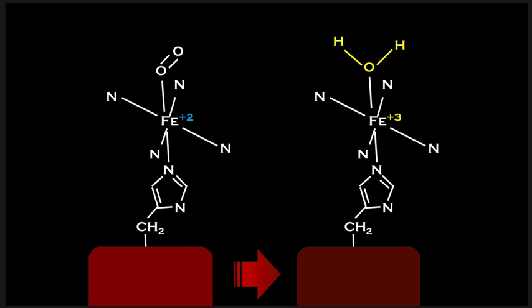Okay, so we've got a more detailed look here, and we've got oxygenated hemoglobin here, their oxygen here, and that'll leave, right? And now we're in our deoxygenated hemoglobin state. And I want you to notice that we've got our iron here, and it's in a +2 state.